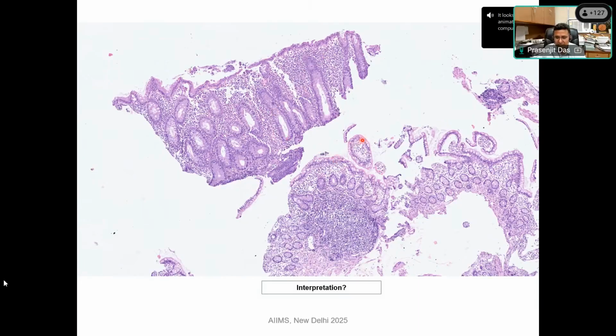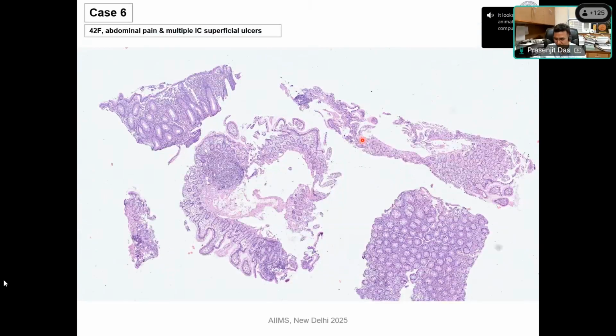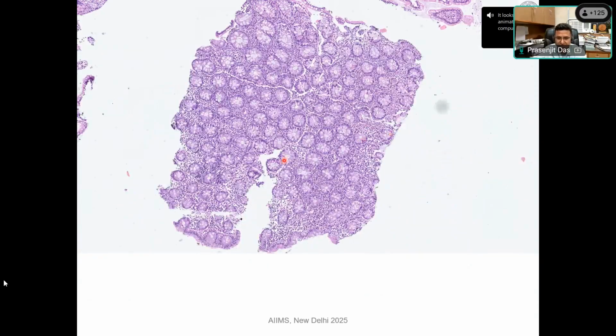Anything further you can suggest? Etiology, did you see granuloma in this case? No, sir. So morphological features are just like either tuberculosis or Crohn's disease. Do you agree? Yes. Okay. That's why we should not tell what it is. We should always say kindly investigate further to determine the etiology. But in this case, we can determine the etiology. Possibly I have cheated with you. I will show you something on higher power.